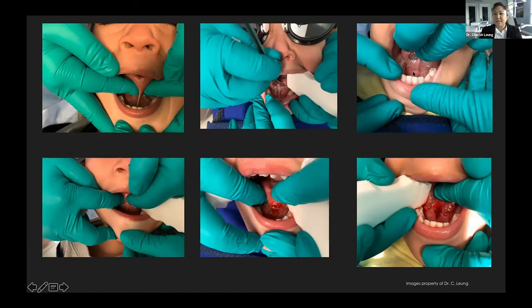And then this is the first case you saw. So posterior tie, not anterior. So again, harder to detect, but having a lot of speech issues, and afterward was great with speech. So you can see here, nice diamond shape. You can really see the difference. And it looks deep, but it wasn't. Super easy and no bleeding. This is right after.